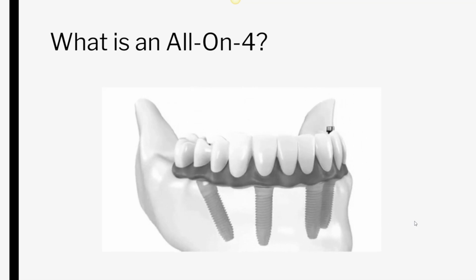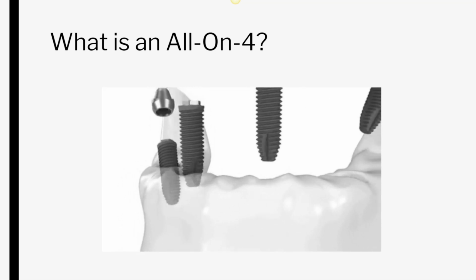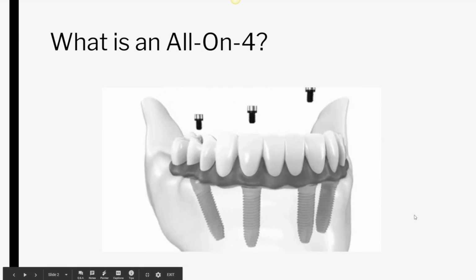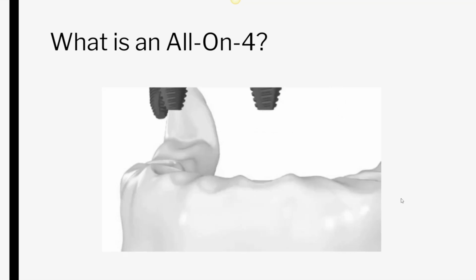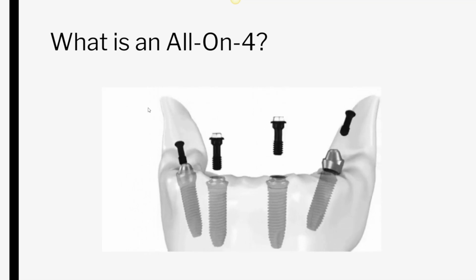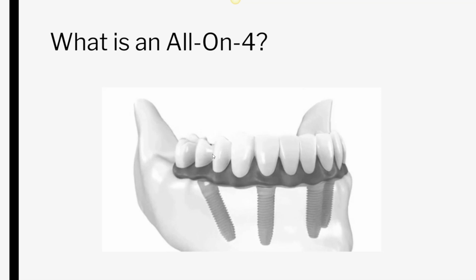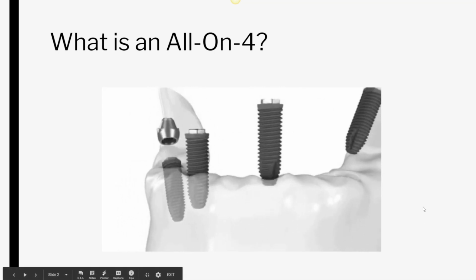I like to tell patients and give a lot of analogies. Essentially, if you're going over a highway overpass, what you want to make sure is that the pillars of support for that highway overpass are spread wide enough apart. So when we're chewing and biting down, you're putting a lot of force on your jaw and therefore the prosthesis. So you want to make sure, especially for the posterior area, that you are placing the dental implants far enough back so that they can really support the back areas where you're putting a lot of chewing forces on your molars. And so that's really why the all-on-4 system is designed the way it is.